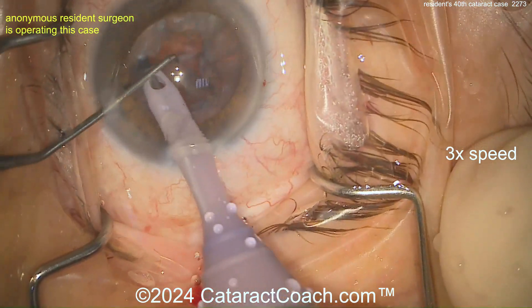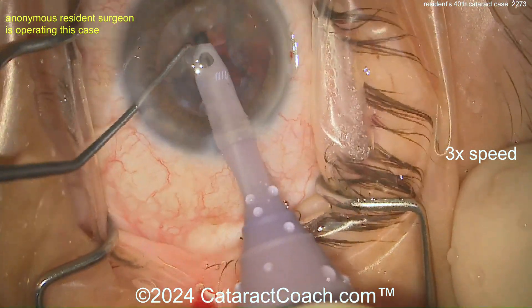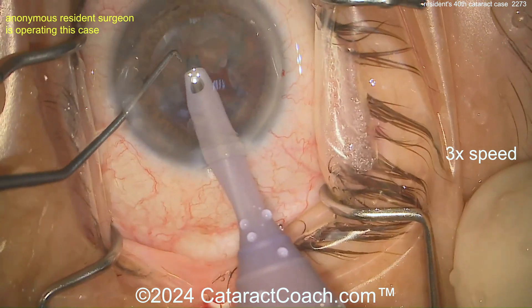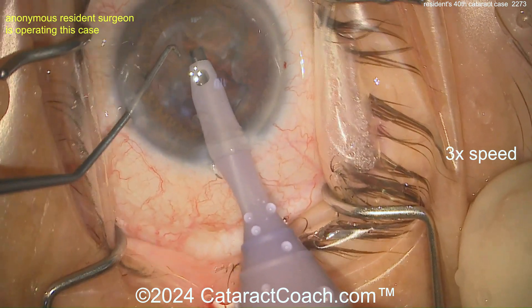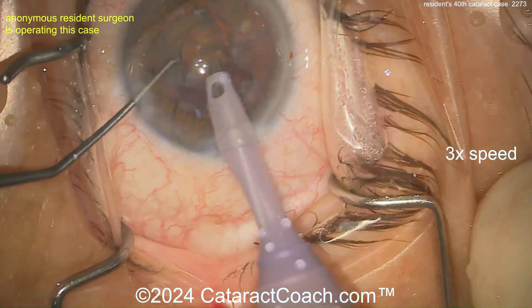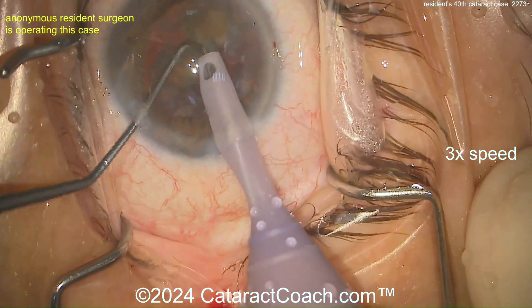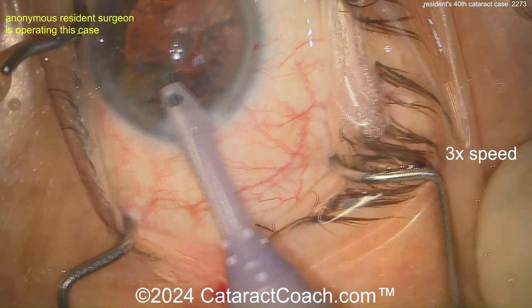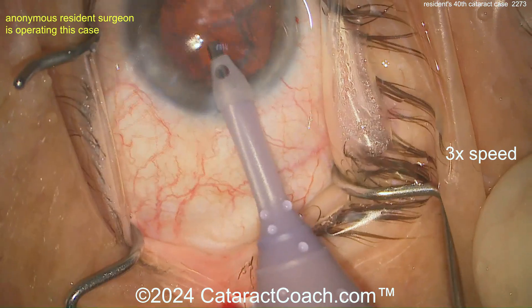That was pretty good — one half came out of that pretty easily. This is a nice case for a resident: not too dense, two-plus nuclear sclerosis, good dilation, and it looks like a very cooperative patient or maybe a retrobulbar block. Looks like a left eye sitting temporal. Getting those other pieces out of the eye — pretty good control. I wish the scope were set up a little bit better, but sometimes it's hard to tell.